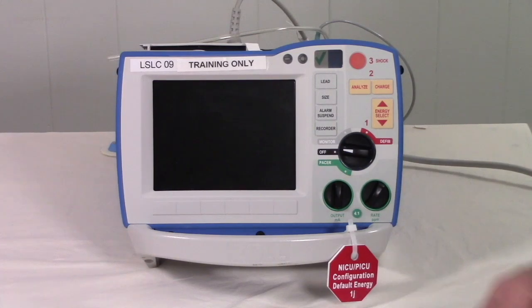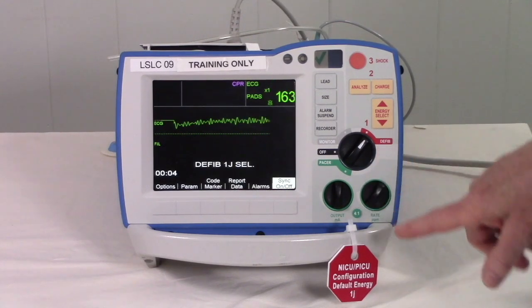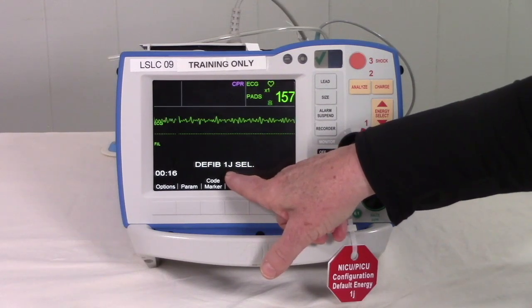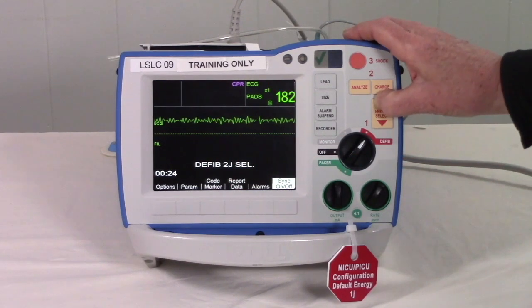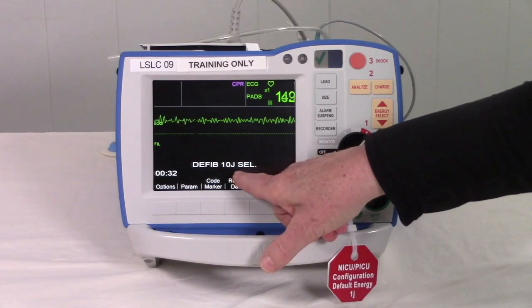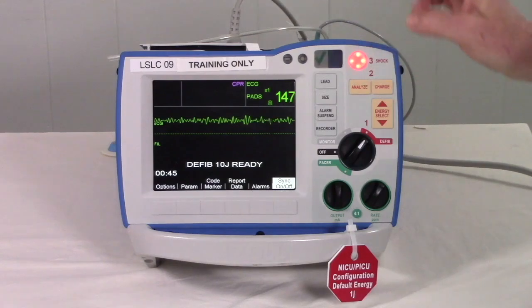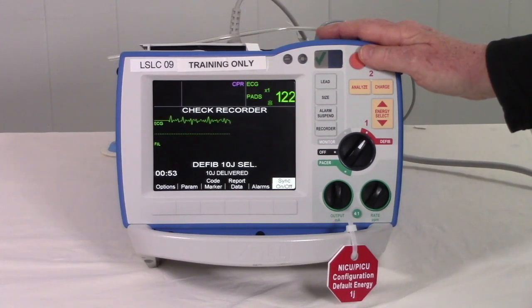For the defib mode, turn your Zoll R-Series to defib. With pads and leads on your patient, notice that the NICU-PICU configuration defaults to 1 joule. Always make sure you're in the right mode and at the right joules. If this baby were 5 kilos, we go with 2 joules per kilo, so we increase to 10 using Energy Select. We're in the right mode at the right joules. Push Charge, keep eyes on the patient — no one touching the patient — count down, shocking on 3: 1, 2, 3. Press Shock. That's the defib mode.